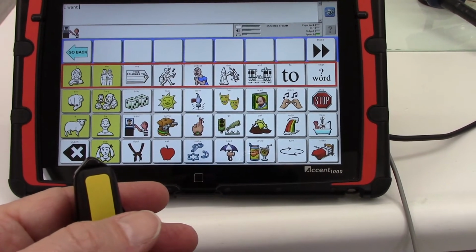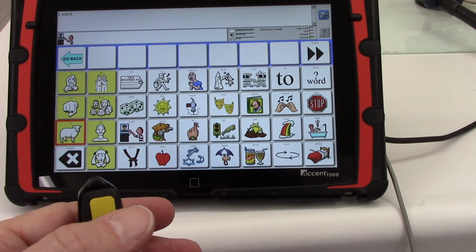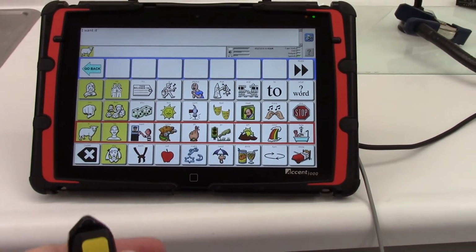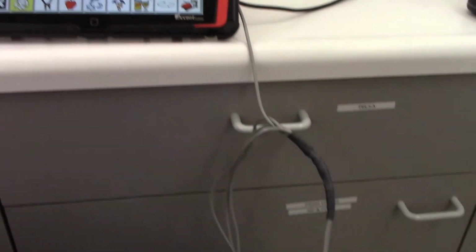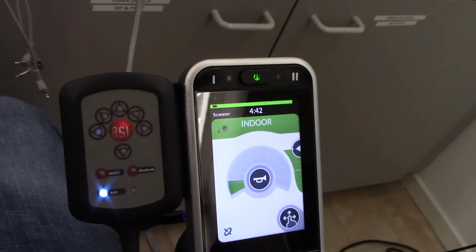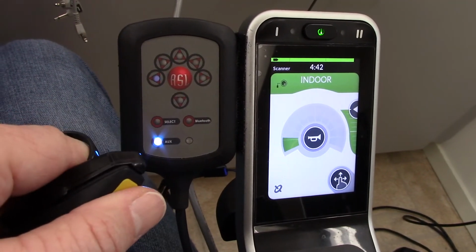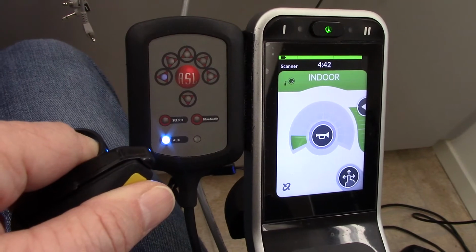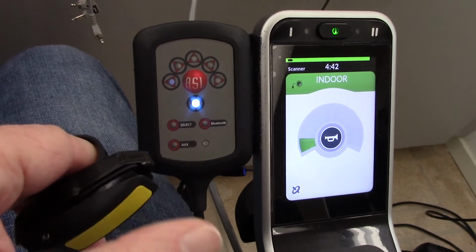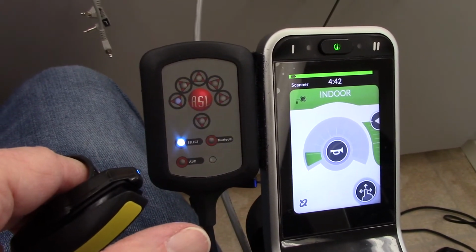Okay, so I have control of this. Okay, now I'm all done scanning with my communication device. I'm going to come down here. But it's still sitting here. I'm not driving. Okay, so I'm going to hold this for 5 seconds. And now I can back up, right? Or move away. There we go. And we're back to driving.